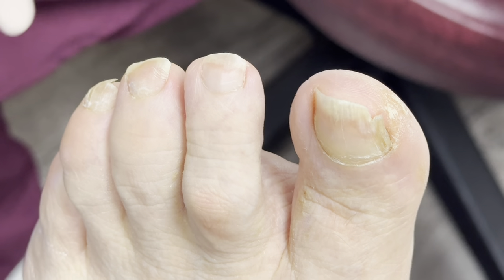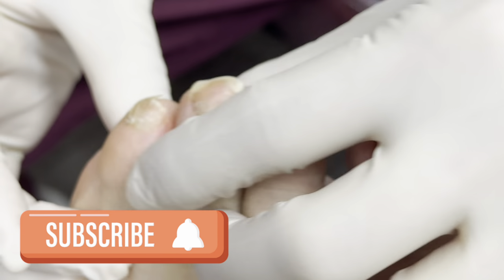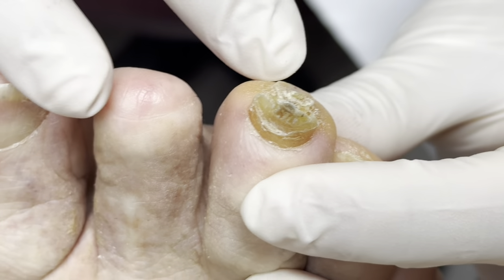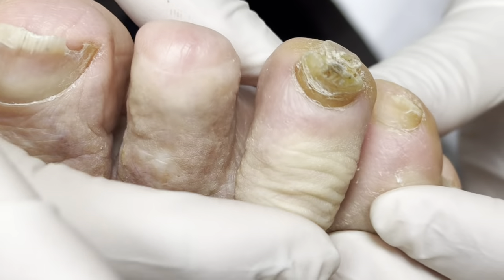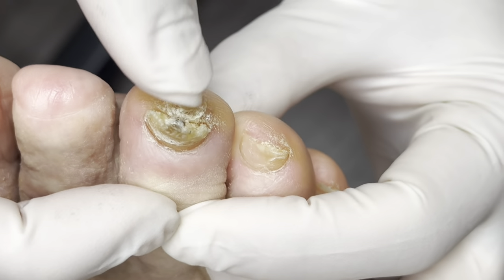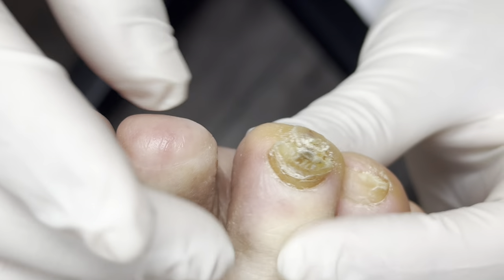We have John here. So John's here to get his nail taken care of, but you can see this — we call it a distal corn. This is a very common problem. He's got a toe that's coming down a little bit, and then it's hitting the tip of the toe, but there's no padding. He should be walking here, but he's walking here, so he's getting the corn here, and then this thick nail is not helping either.